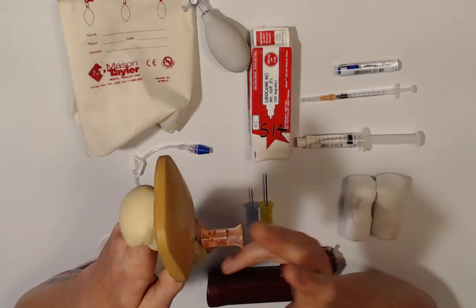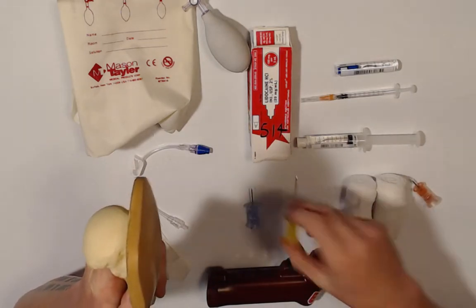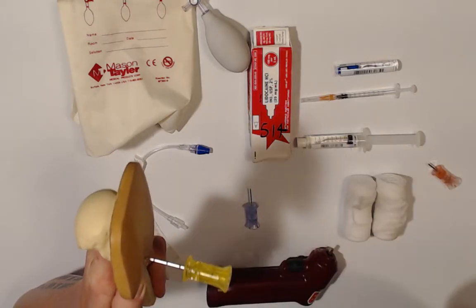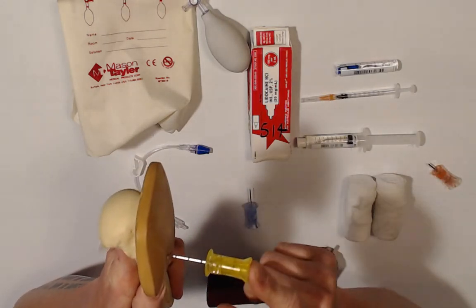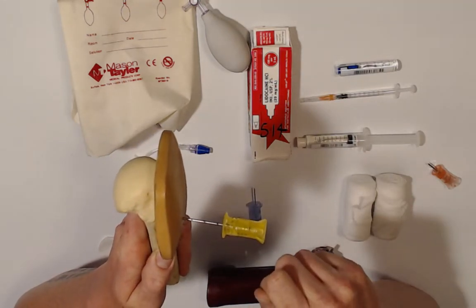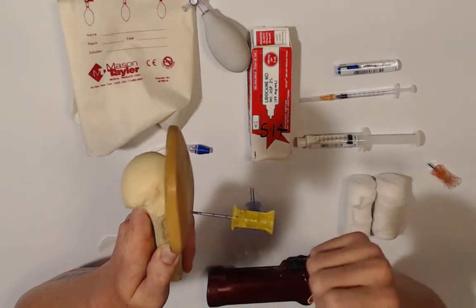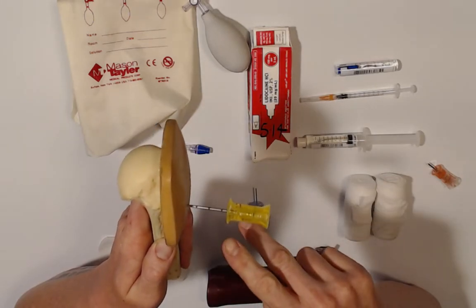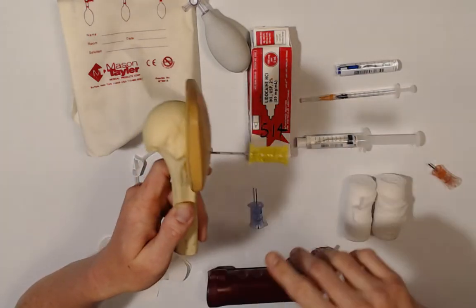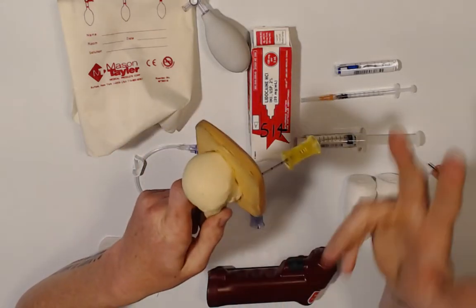Now, if you have not drilled this site yet, we can remove this out, find the bigger option, and you can go through the same hole. Okay. Obviously, you probably want to wipe it off again with alcohol before you do, but use the same hole if you have not drilled. If we've already attempted our drill and punched a hole in the bone, then that site is gone, no more. You got to go to another location. Okay. Reason being, if we punch a second hole in this bone, once we start infusing medications or fluid, it's just going to leak out through that original hole and possibly cause problems as far as necrosis, and of course you're going to have swelling of that site.